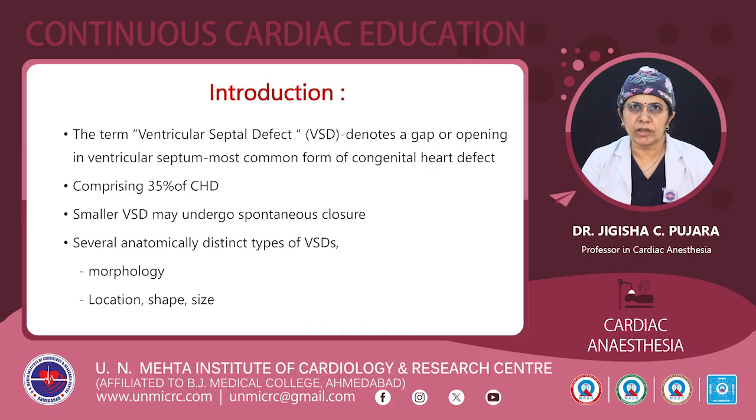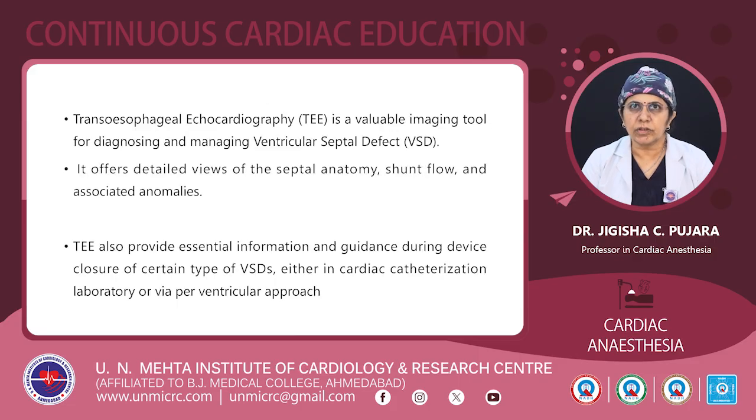There are several anatomically distinct types of VSD, classified morphologically, by location, by shape, and by size. Transesophageal echocardiography is a valuable imaging tool for diagnosing and managing ventricular septal defect. It offers a detailed view of septal anatomy, shunt flow, and associated anomalies. TEE also provides essential information and guidance during device closure of certain types of VSDs, either in the cardiac catheterization laboratory, via the perventricular approach, or in the surgical field.